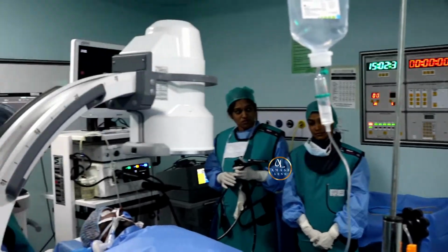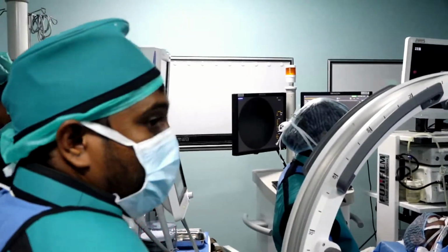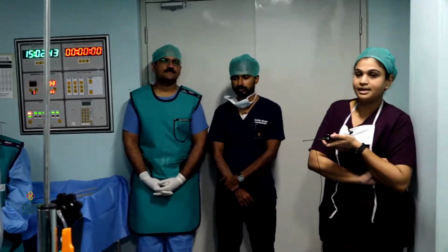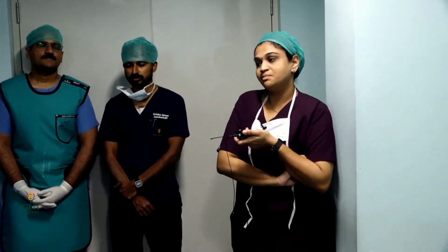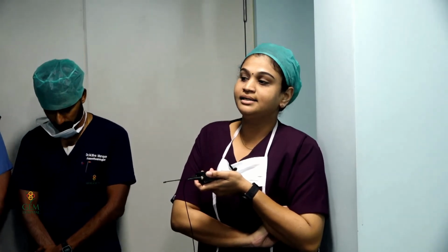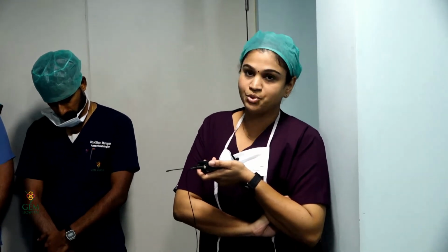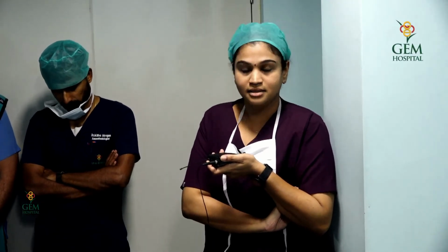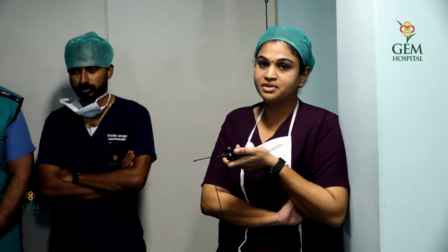Let's go forward with the case. I'll first introduce the case. We have a 50-year-old gentleman who has come with obstructive jaundice and pain abdomen. Patient has a past history of laparoscopic cholecystectomy done 2 years back. And he has done an MRCP imaging, which has showed 6 mm distal CBD calculi with a dilated common hepatic duct and IHPR, and will be going forward for ERCP of the same case.